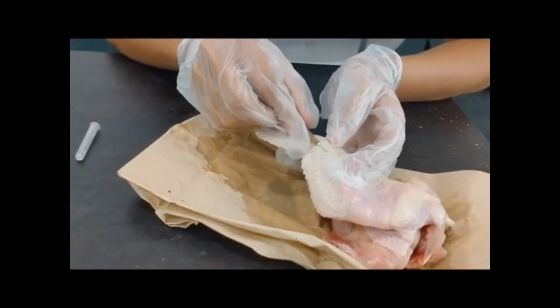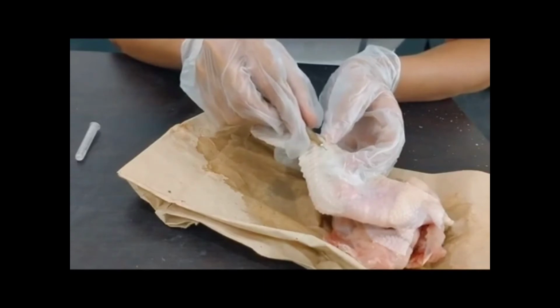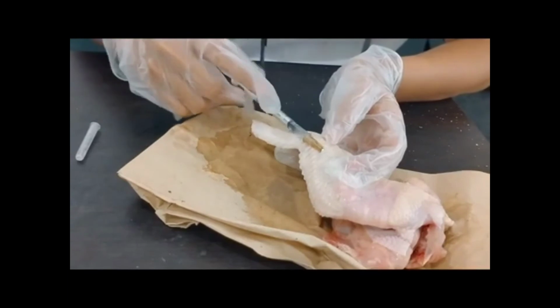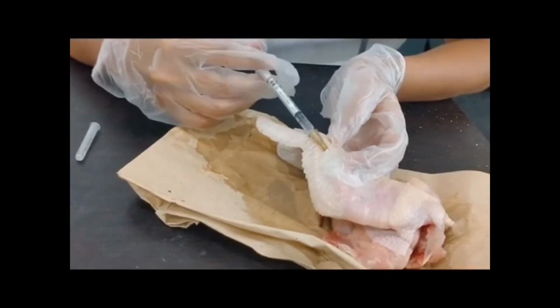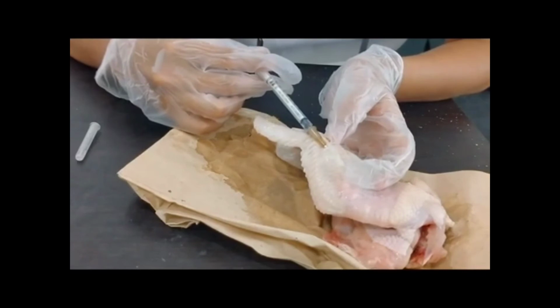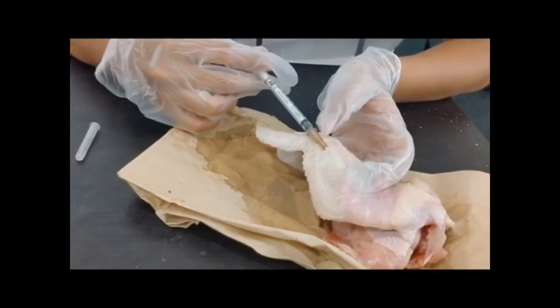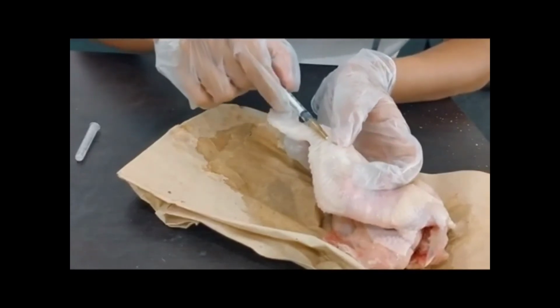So for intradermal, we will inject it at a 15 degree angle to our patient. This is a skin test. And now push the plunger of the tuberculin syringe. That's it. After that, let us now pull out the tuberculin syringe.